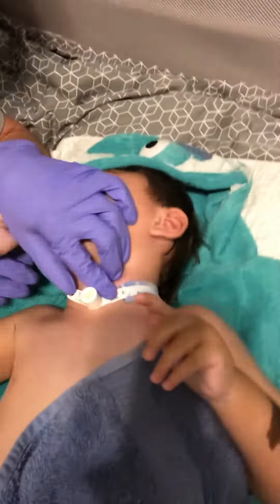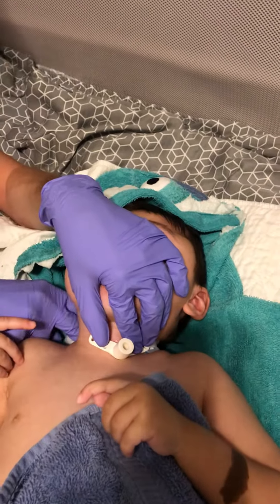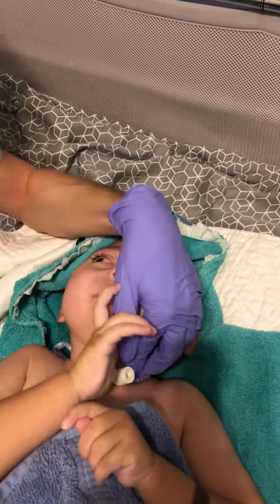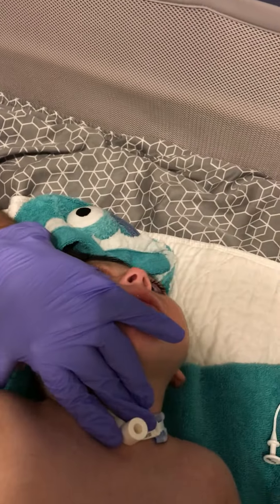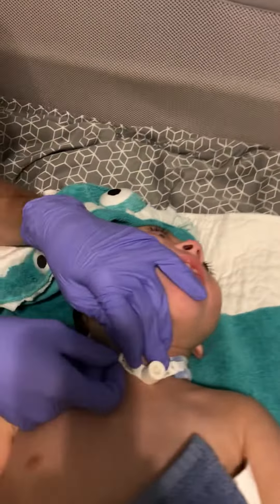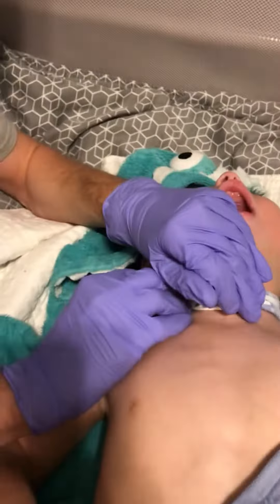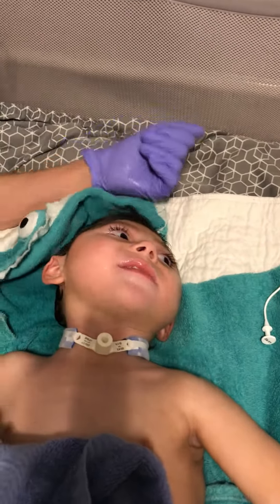And then we will reattach his trach ties. Okay, just got stuck. All done. Good job, buddy. All done. There you go, all done.